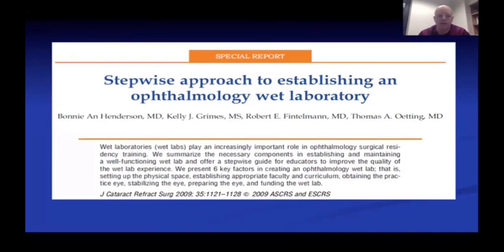But there are multiple good animal models that are very helpful for practicing phaco surgery, suturing, practicing anterior segment surgery. We've tended to steer away a little bit from animal tissue now because we have the funding to purchase the artificial eyes. But otherwise, we have a lot of cattle and pigs in this region of the world in Iowa, so we do utilize tissue from those animals for practice.